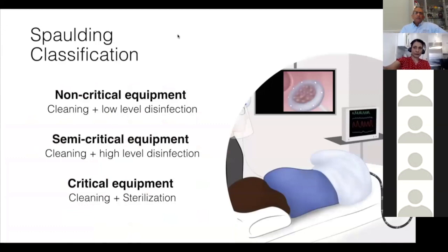So before we go any further, I want to give you a broad classification of the equipment that we use in the endoscopy unit or in the hospital.